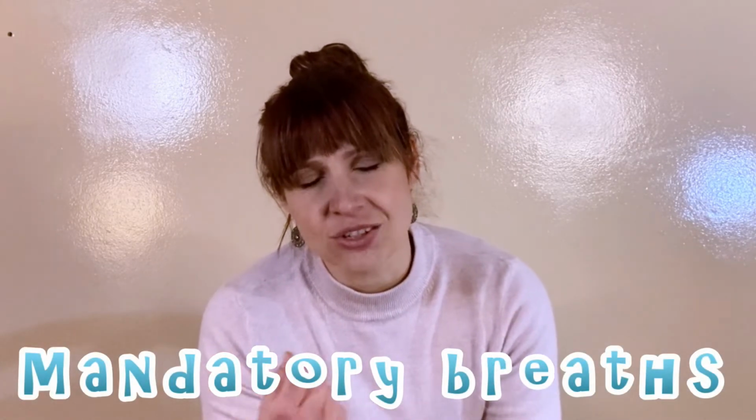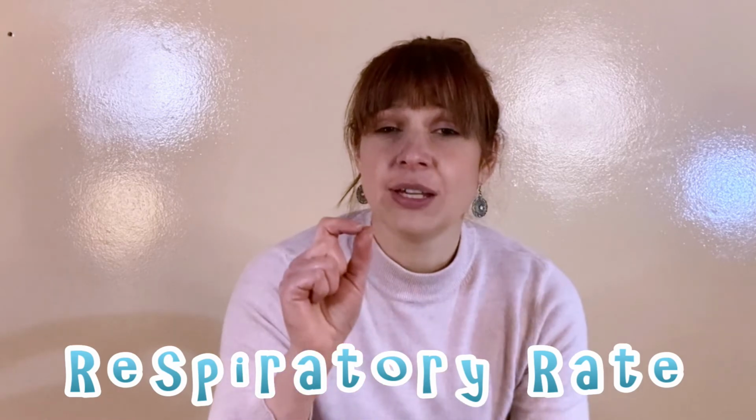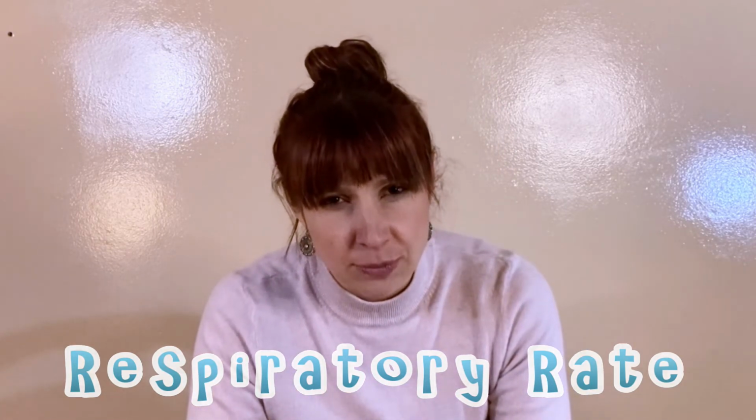And we call those breaths controlled breaths, or we also call them mandatory breaths, meaning we have insisted that this breath is going to happen. Whether you like it or not, patient, it's coming your way. Here's a breath, boop, that you neither asked for and did not initiate, but you need it. That brings us to our next final concept. We need to decide how many of those. So we're going to set a rate, a respiratory rate of mandatory breaths.